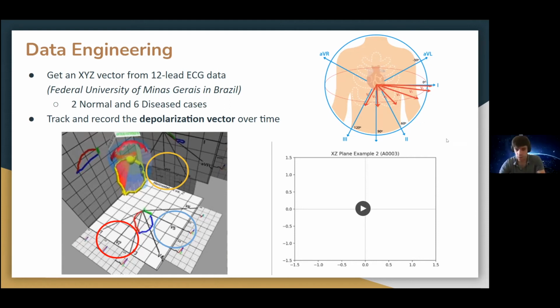So just to expand on what Trevor said, I think what you were getting at, Brian, is that generally with neural nets or with AIs, you need big data in order to come to one single model. What Trevor was saying is that here we are distilling one set of 12 lead ECG data that belongs to one person into an XYZ vector, which we can generalize for a larger population. So rather than taking a lot of data and saying that's one specific model, we're taking one specific person and generalizing it for an entire population. I think that's what you were kind of getting at.